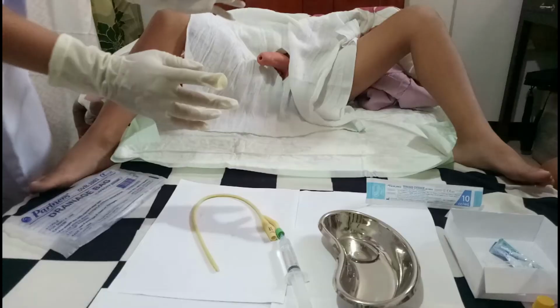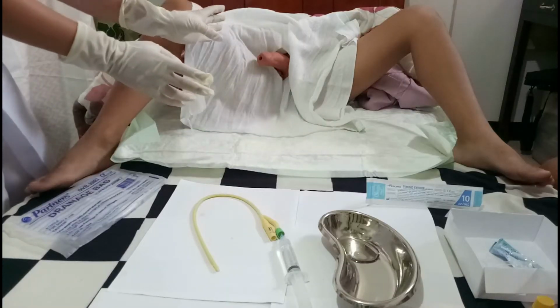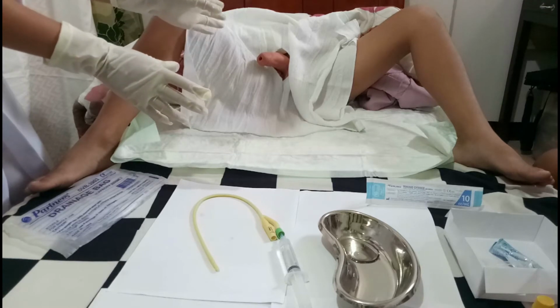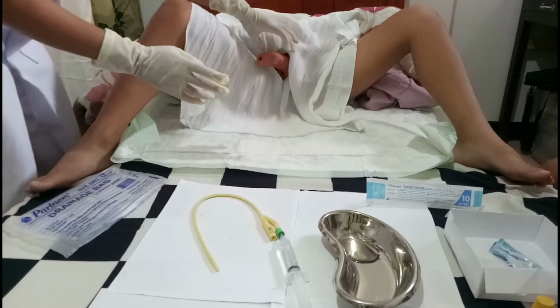And now I'm going to prepare the patient and clean his penis from inner to outer portion. So now I'm going to use my non-dominant hand to touch the penis of the patient. So, sir, I'm going to hold your penis now, okay?